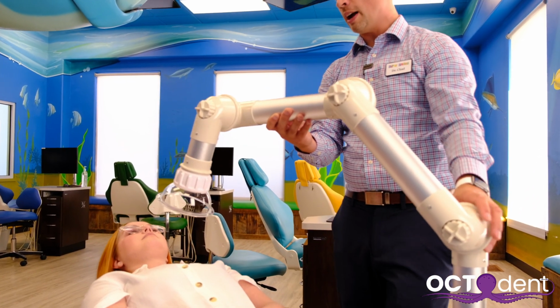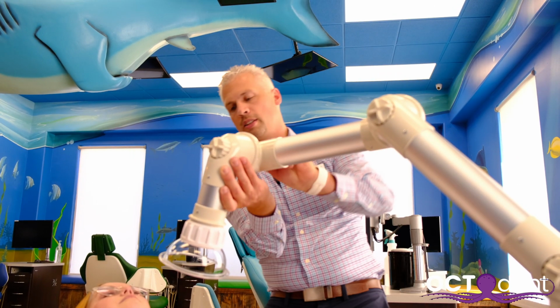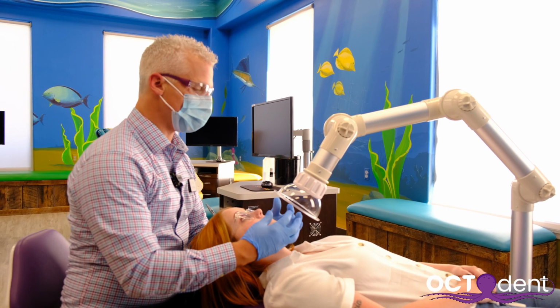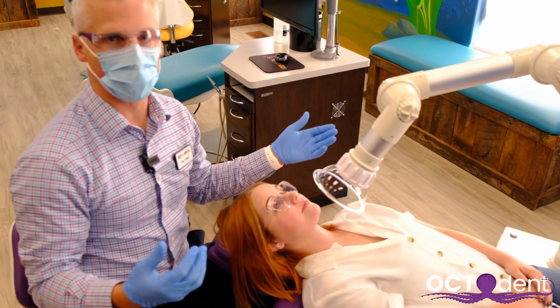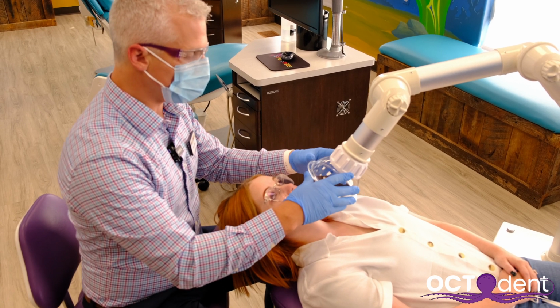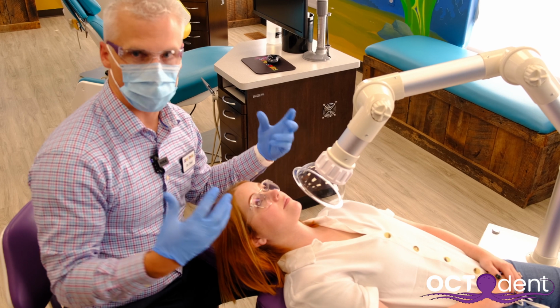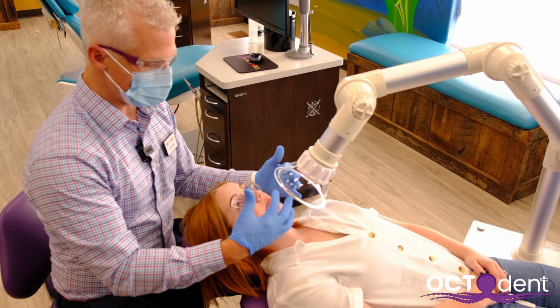So a lot of times I'll have the unit positioned about like this right here. When I have this positioned right here, it's over top of the face, so it's capturing and suctioning all those aerosols, so I'm able to get in here and clean. So this might be a situation where I have the unit on a level 4. But as you can see, this is a little close if I had four-handed dentistry or a lot of things in the way. But this is really effective, and I can have the unit on a very low CFM, and it can be very effective at this distance right here.